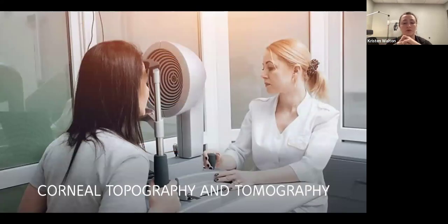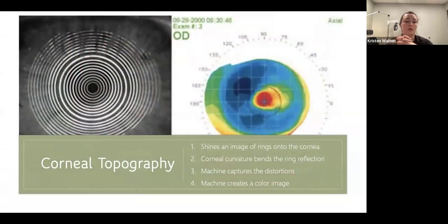Okay, and then we get into corneal topography and tomography. So corneal topography is just the mapping of the very front surface of the eyes. So there's a placido disc image here where it's just a bunch of rings that are shined onto the cornea. And then we get this reflection back of what those rings and the integrity of those rings look like. Corneal curvature bends the ring reflection. If we have any irregularities, then you're going to see it within those rings. It's going to capture that distortion, and then we get a nice color image to kind of represent what that topography looks like.